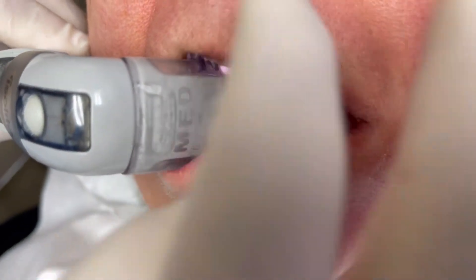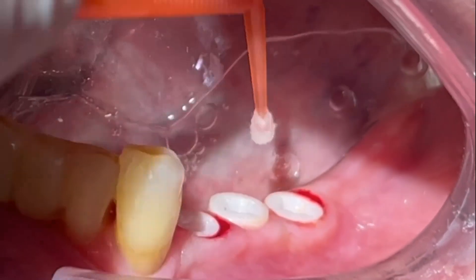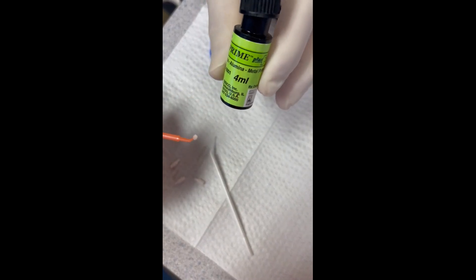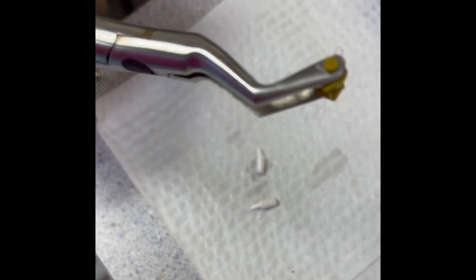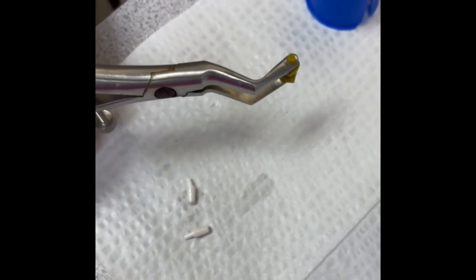Here I'm going to go into a little more detail on the cementation process. We use an Isolite appliance to have the patient bite down and keep the area clean and dry. We then clean the internal surfaces of the implant with mild bleach, rinse, and dry.